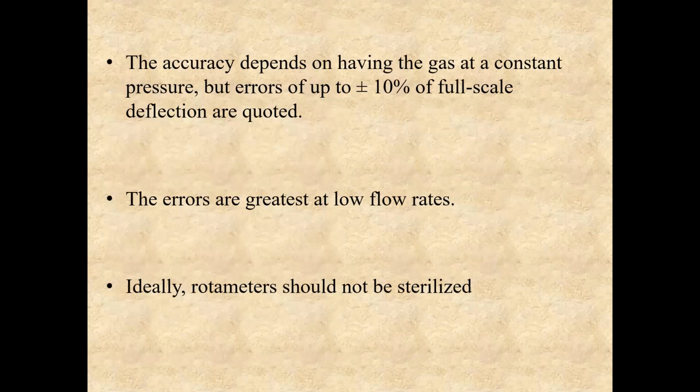Is this rotameter accurate? Yes, the accuracy depends on having the gas at a constant pressure, but errors up to plus or minus 10% of full scale deflection are quoted. And the errors are greatest at low flow rates. Now, ideally, these rotameters should not be sterilized.